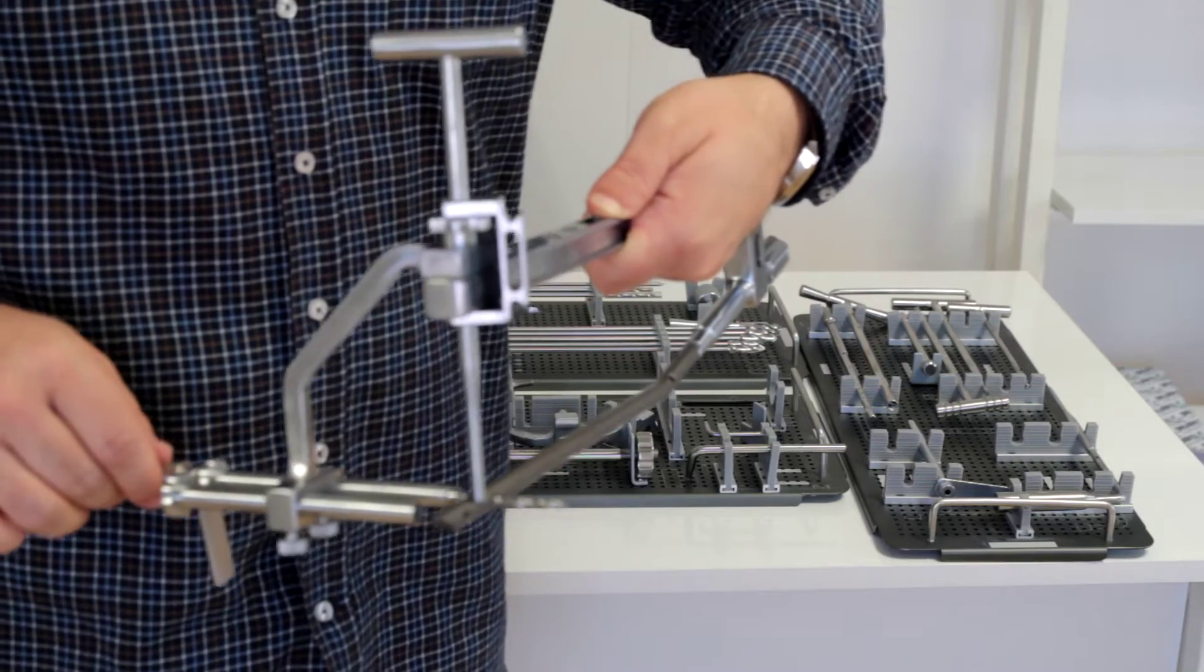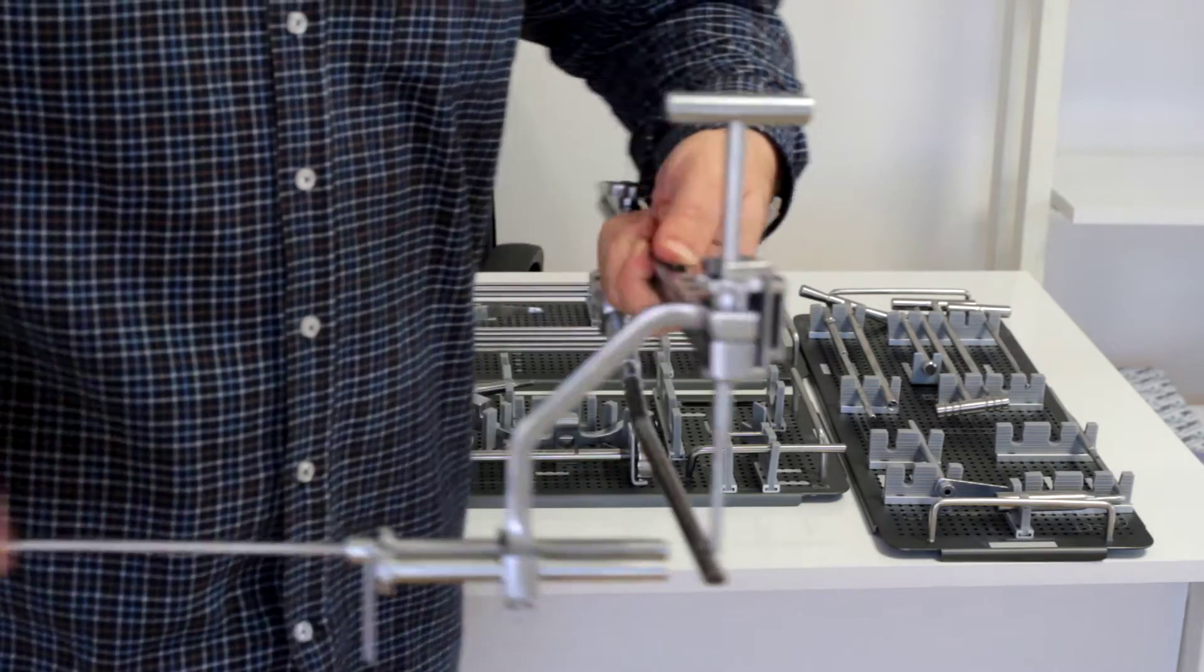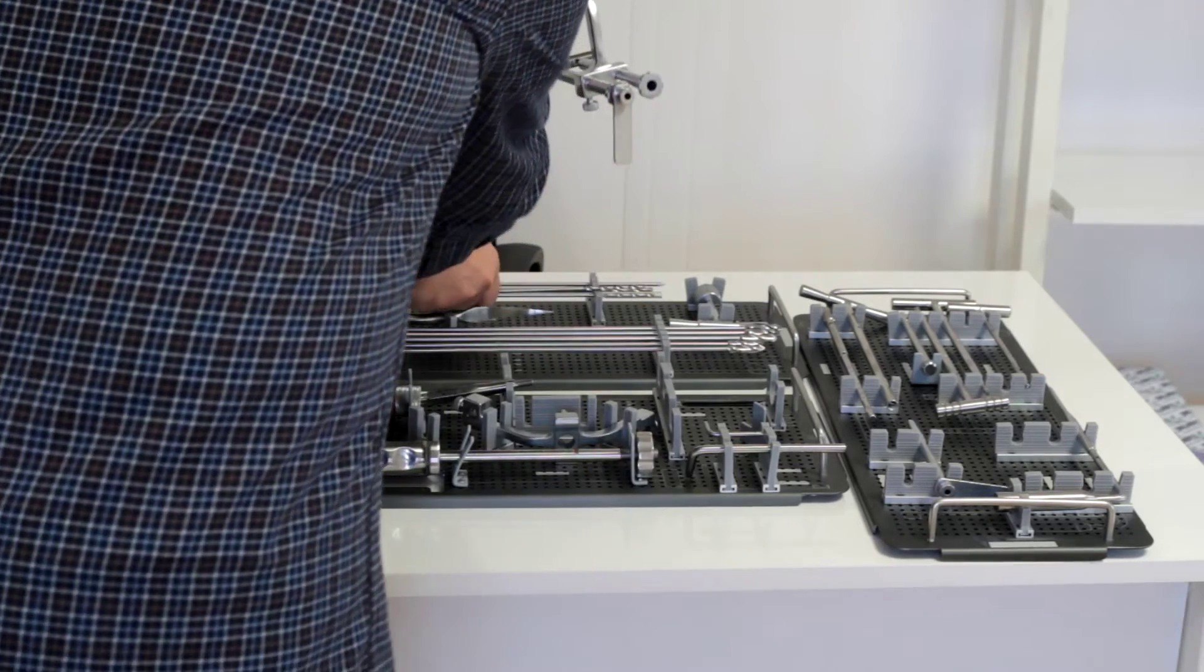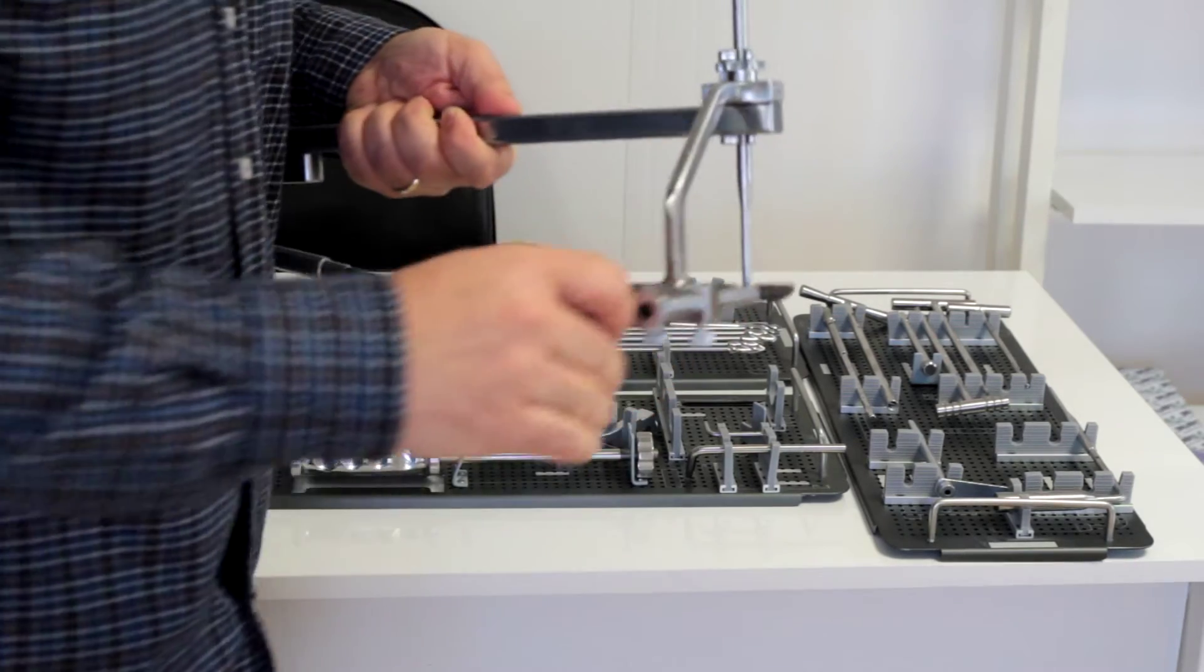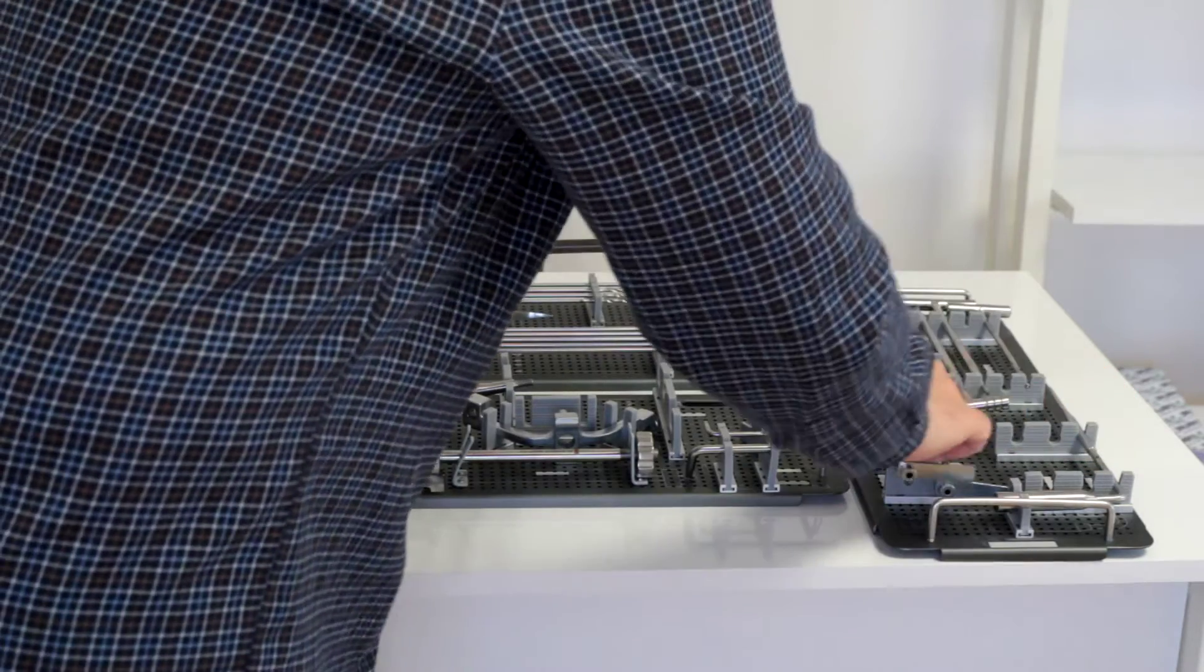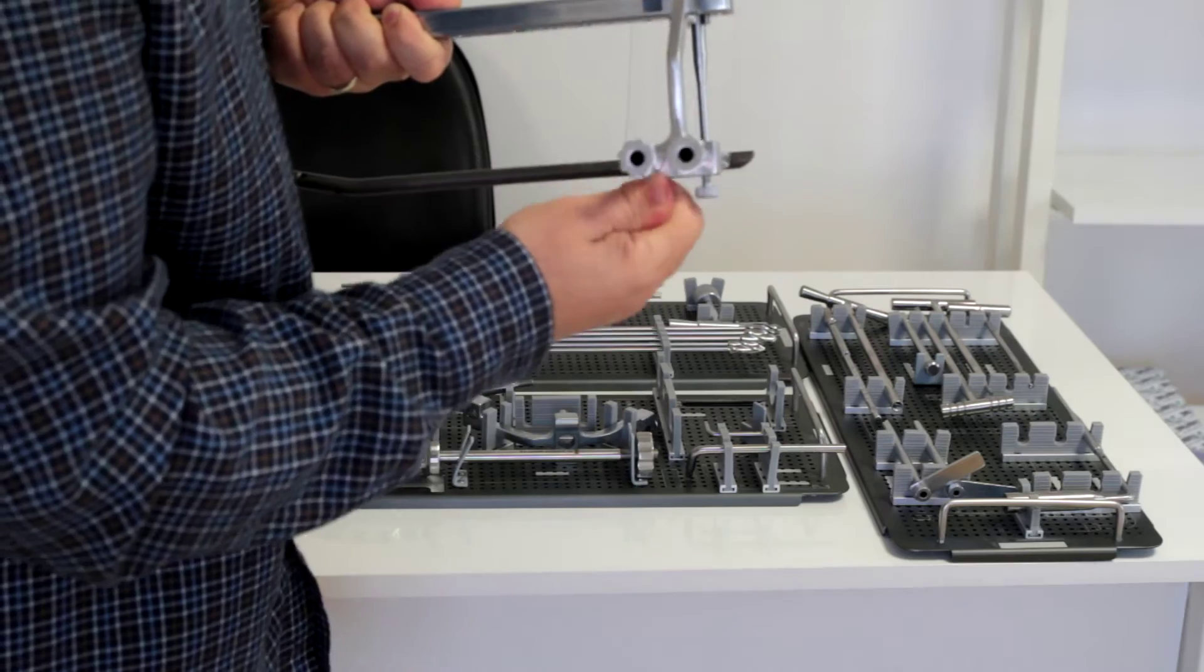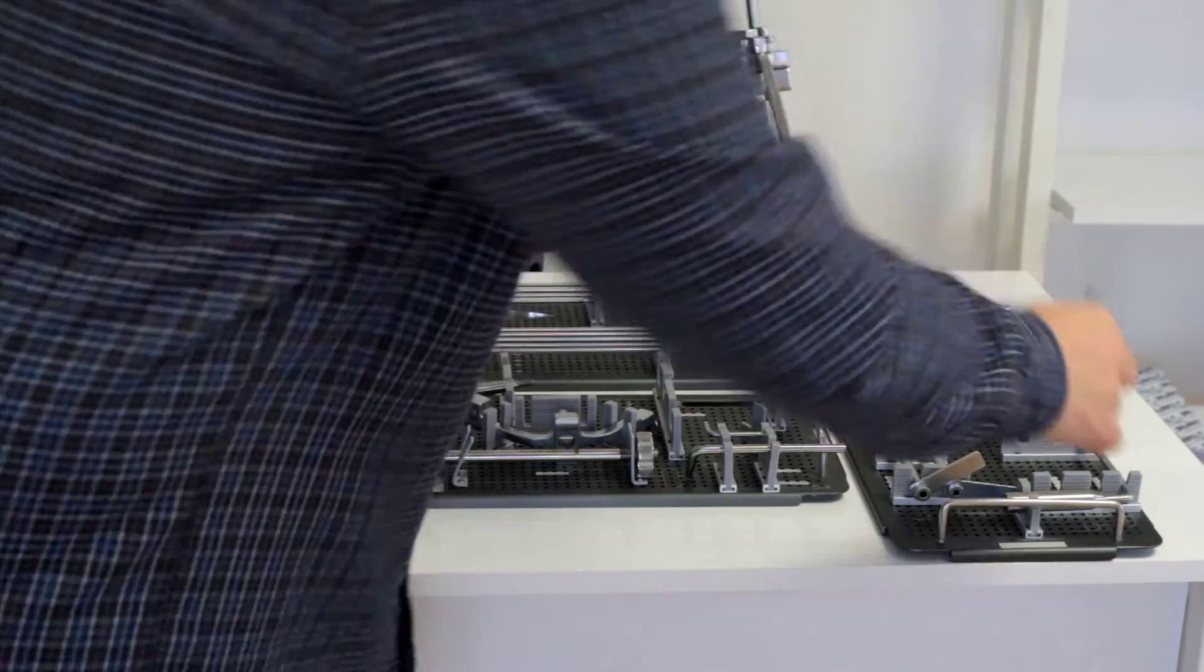You can use the drill exactly in its place. After locking the nail, you have to replace the guide. So we are actually removing the sleeves.